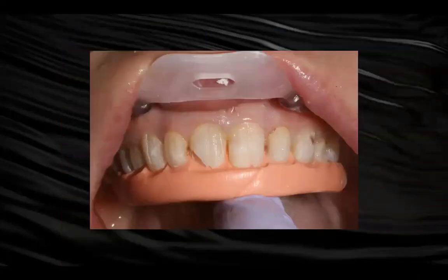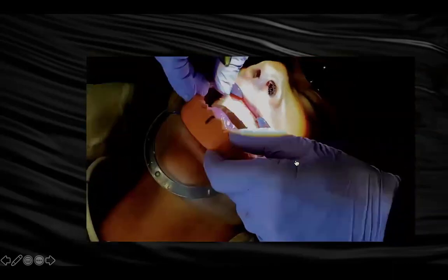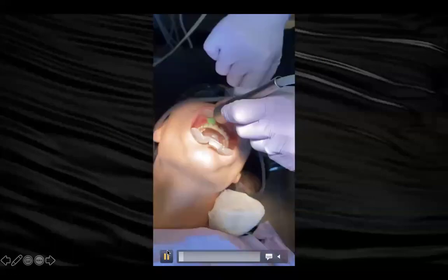After I got the veneers off, this tooth had a lot of damage before, but I preserved a lot of tooth structure for her. And after we prepped, we created these beautiful temps for her. Excuse me, I skipped that, but I've got to keep things rolling along.